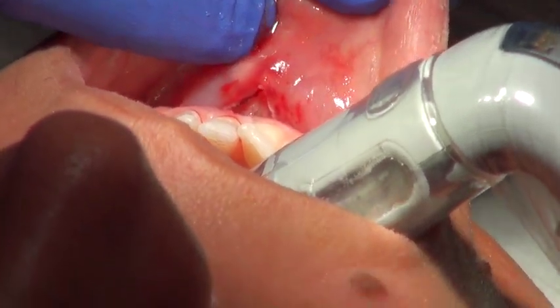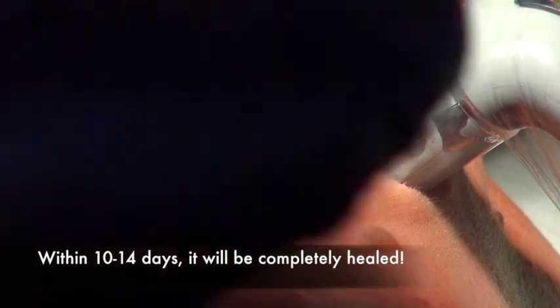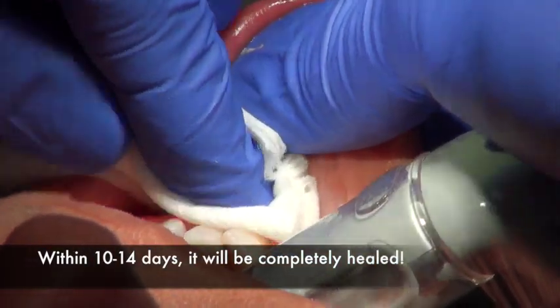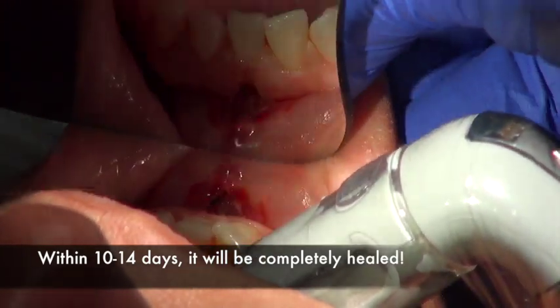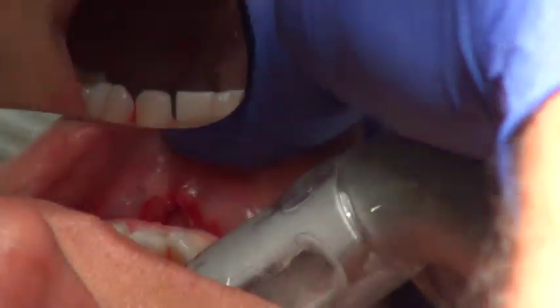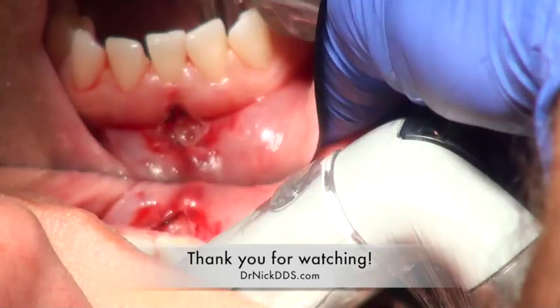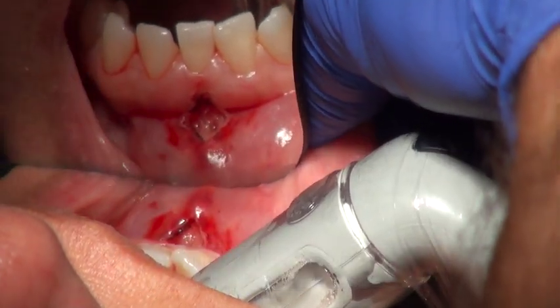See, John? Wow. Give me the mirror. Is this what you wanted? Fine. Can you see it? Get a little more light on it. Put the light on it. Can you see it, Will? Yeah. That's a real good image. Good.